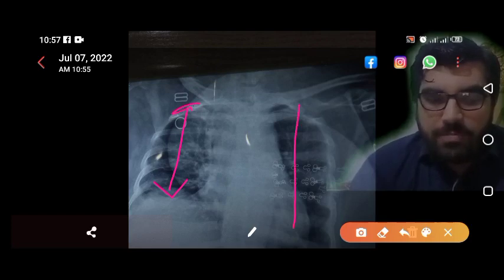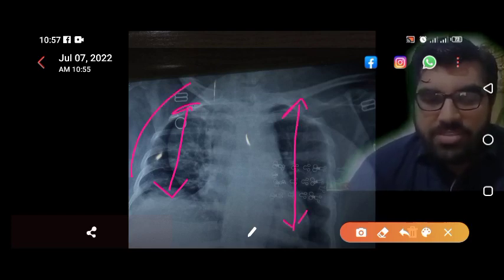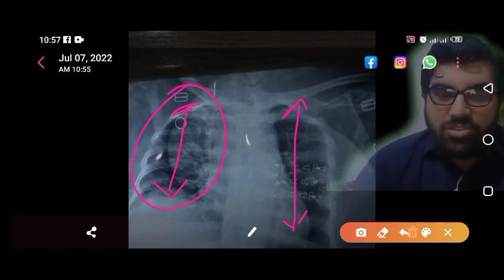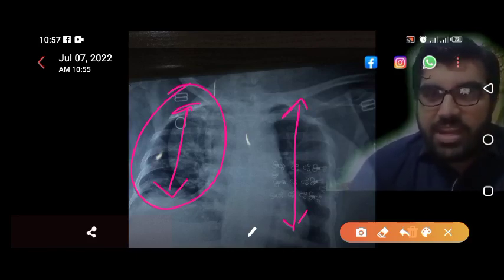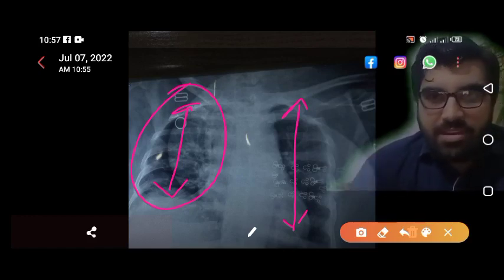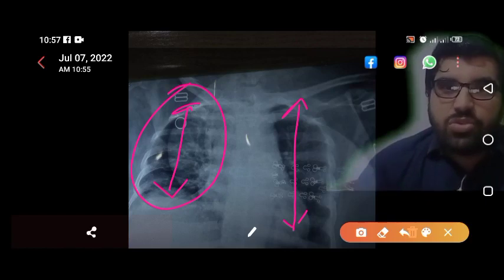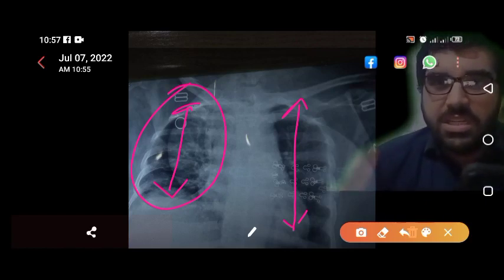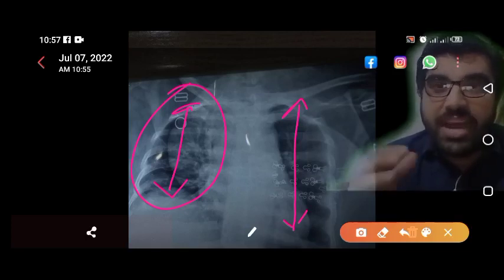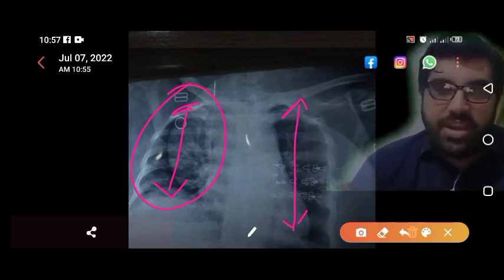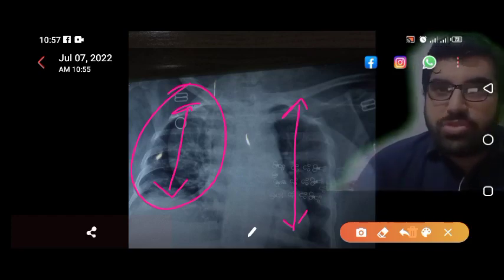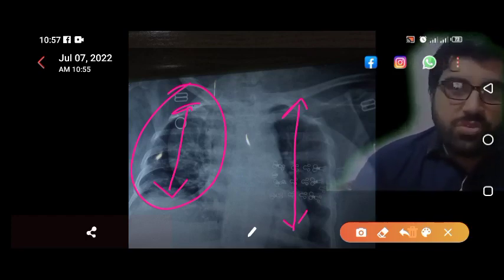The second abnormality in this X-ray is decreased lung volume bilaterally, more on the right side. In a patient diagnosed with rheumatoid arthritis, you should think of ILD — interstitial lung disease. There are two types of ILD in rheumatoid arthritis: one is connective tissue disease-related ILD due to rheumatoid arthritis itself, and the other is a side effect of methotrexate — long-term methotrexate use leads to fibrosis.